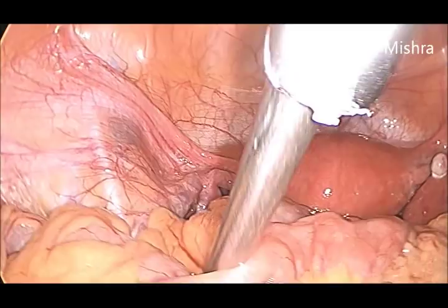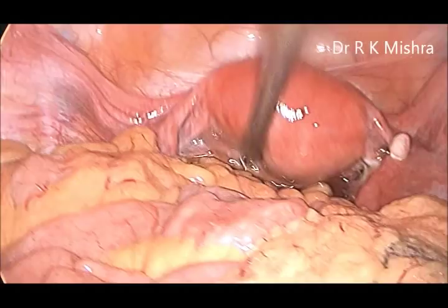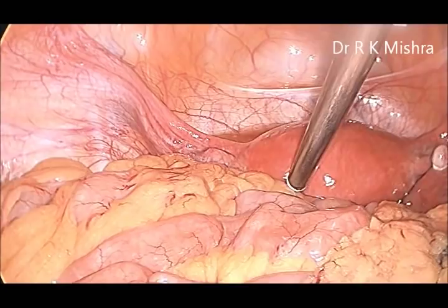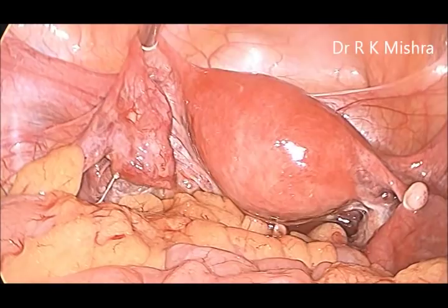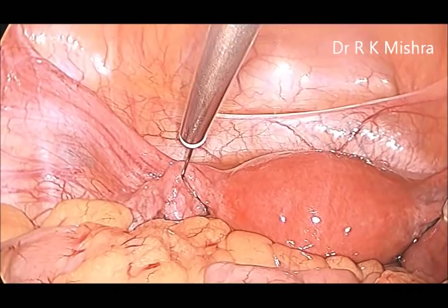To locate the tube with the closed jaw — here this is the triangle of doom, this is the external iliac artery and vein you can see there on the left side. Now to locate the tube, you just go behind the uterus and lift the tube up with the jaw of the fallop ring applicator inside. Then you take the jaw out and just two centimeters lateral to the uterus you can catch the tube and fire slowly.